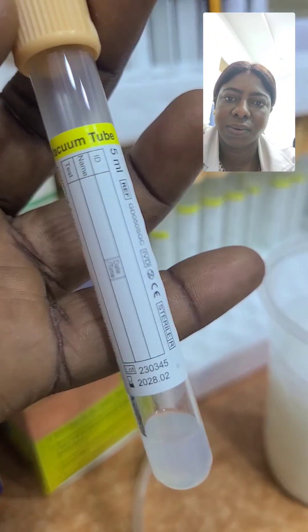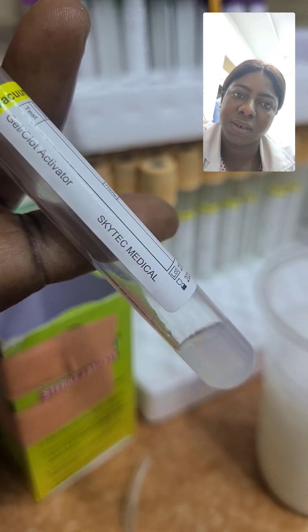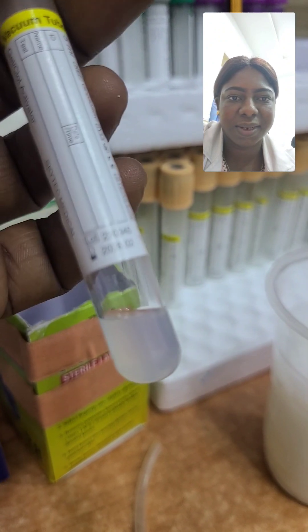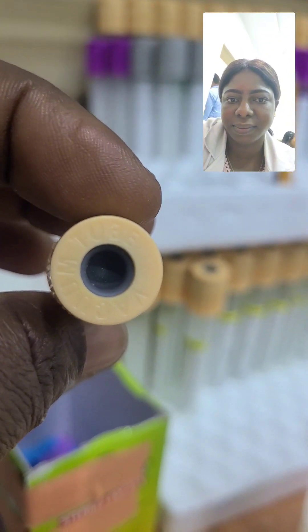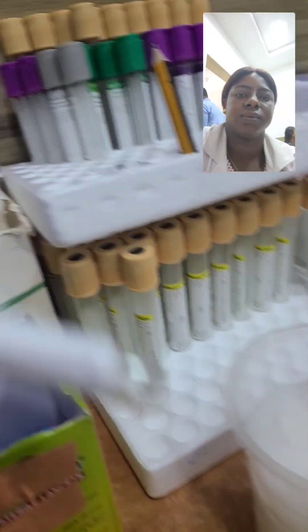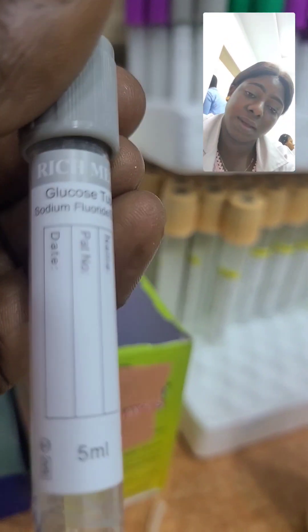This one is a gel tube — a gel clot activator tube. As you can see, the gel is inside. We use it for chemistry tests; we collect our chemistry samples inside, like lipid profile, electrolytes, urea and creatinine, liver function test, and so on.